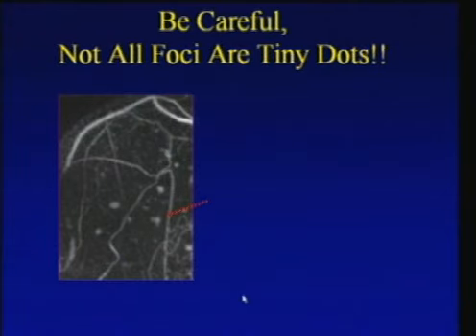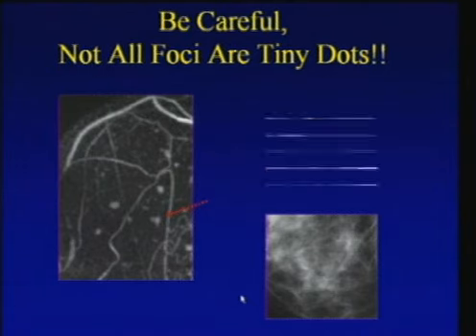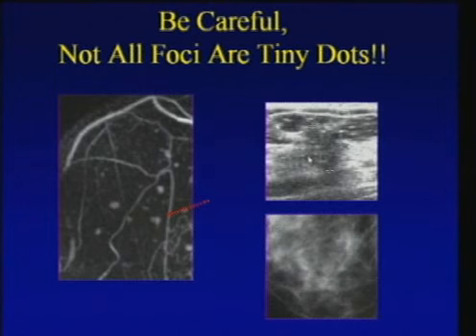So we thought that was abnormal, called the patient back for a dedicated mammogram, which was also normal, and then on ultrasound, we saw a very small, ill-defined hypoechoic mass. This was biopsied, and this is a 5 millimeter cancer.